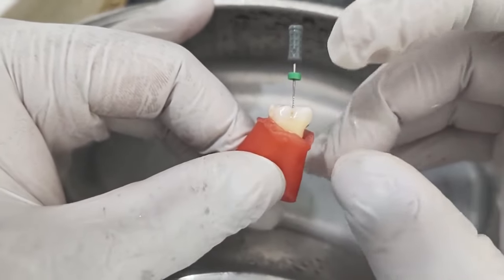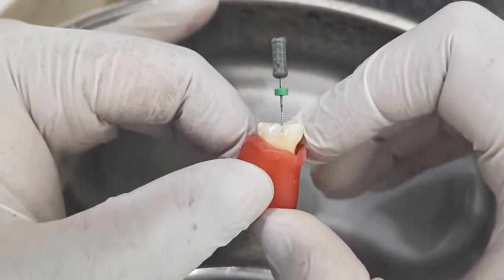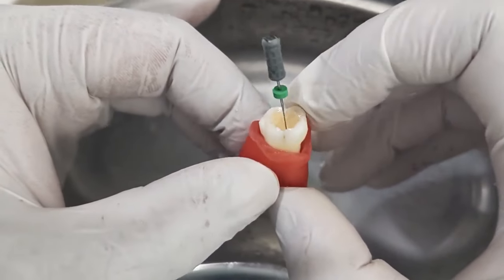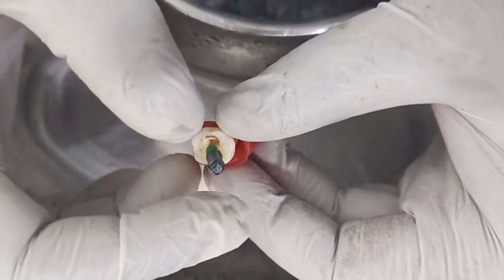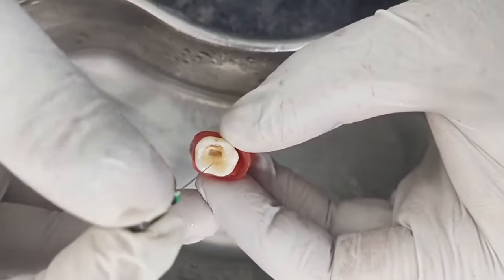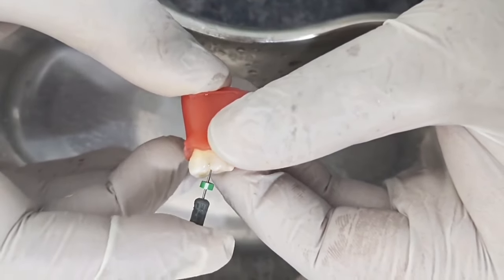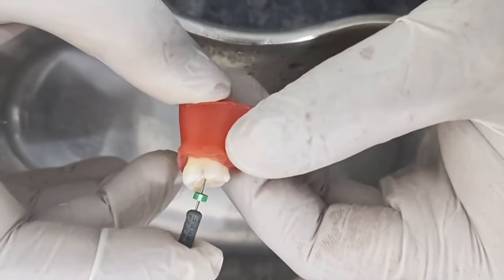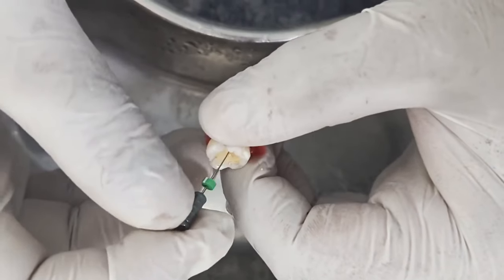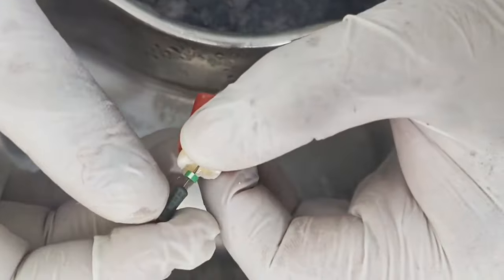Sometimes we may not be able to see the mesolingual canal where I put my file, due to the bleeding and all, we cannot see the canals. It's also not visible in patients who have less mouth opening. Now next, this is the distal canal. I'll just show you the angulation. This is the distal approach for the distal canal. After this, we have to take one x-ray of the particular tooth to know the working length, or you can use an apex locator in the patient.